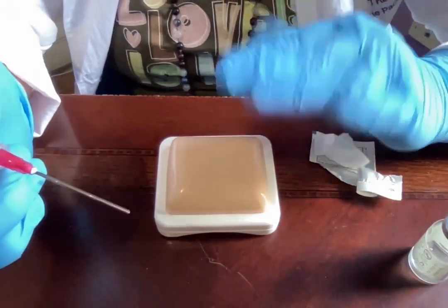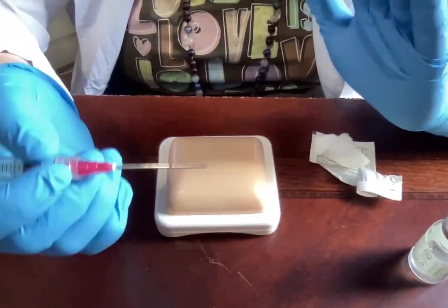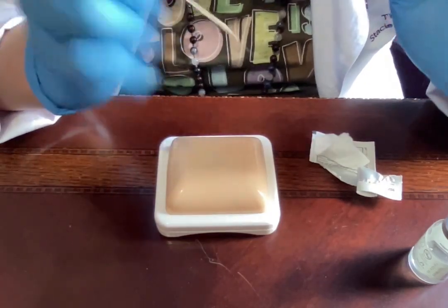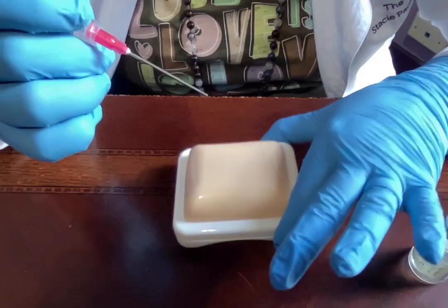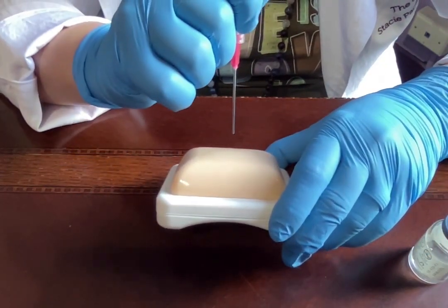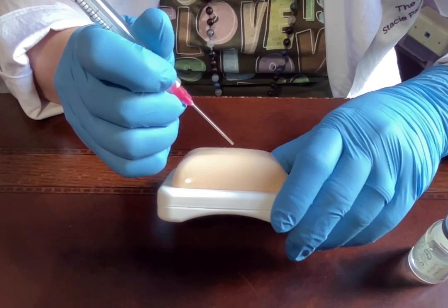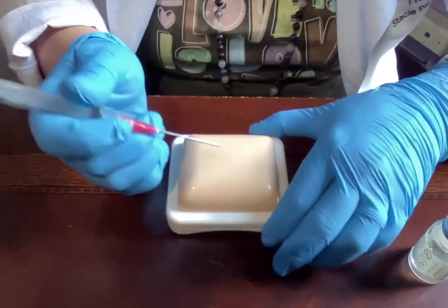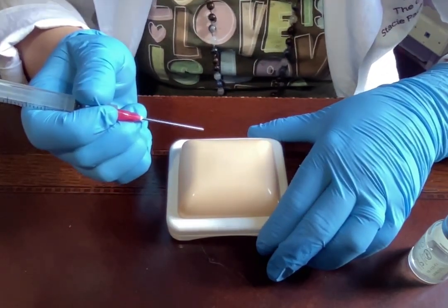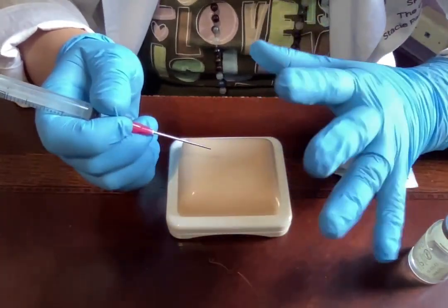Now the injection site has air-dried from where we applied the alcohol, so we're good to go. We are going to be injecting with a dart-like motion — quickly, not slowly. We'll do it at a 45-degree angle. Just so you can see: 90 degrees is straight up and down, and 45 degrees is about half of that.